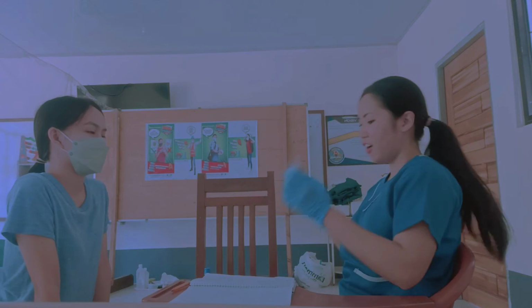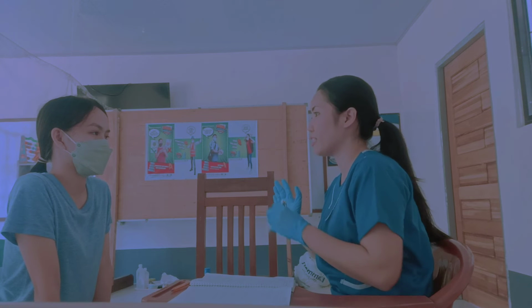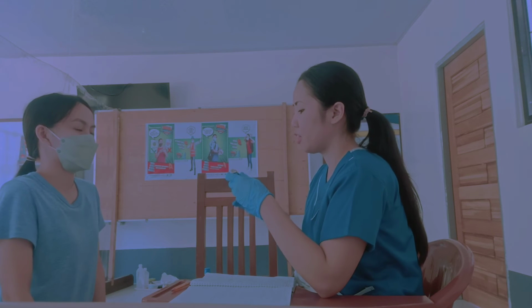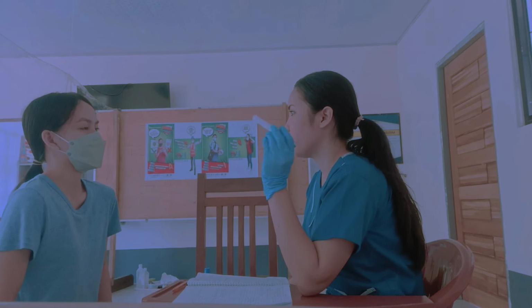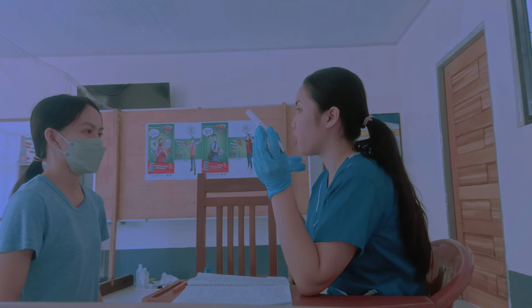Okay, so I'm going to check the direct response of your pupils to light when it is dark. Okay, I'm going to turn off the lights. Okay, so now our lights are already turned off. Now I'm going to shine light on your pupils. Then you have to look straight to a far object.